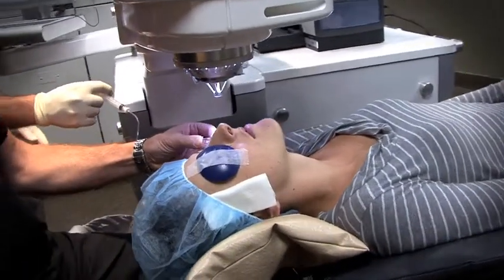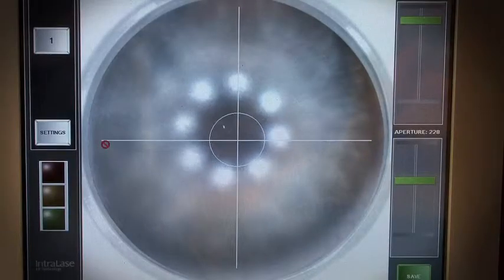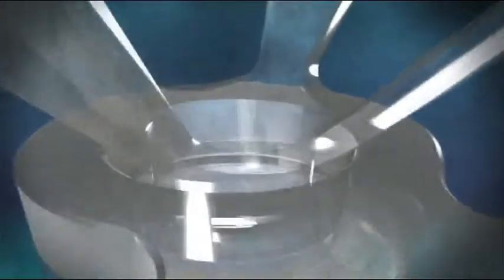At this point, we will swing you in your chair underneath a different microscope. This microscope is attached to the laser that we're going to be using to make the flap for your procedure. As the laser begins to do its work, you will have no sensation of it working at all. You will not see, hear, feel, or smell the laser as it is firing. It takes less than 15 seconds for it to make that flap.